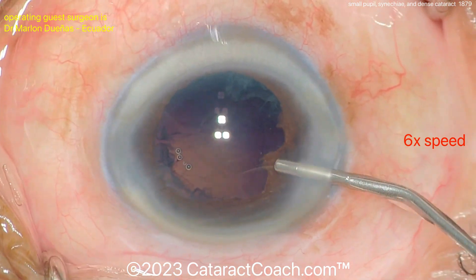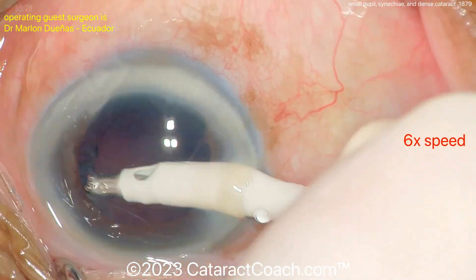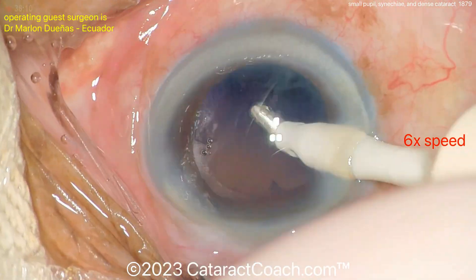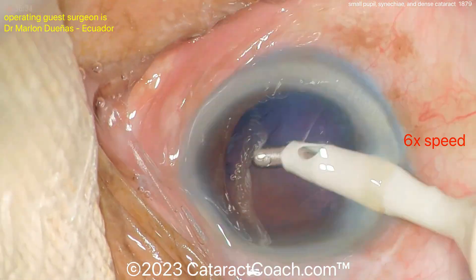Cortex removal: a little more viscoelastic first, then coaxial cortex removal — the most common approach. Bi-manual irrigation/aspiration is reserved for more challenging cases. The cortex is cleaned up pretty nicely.